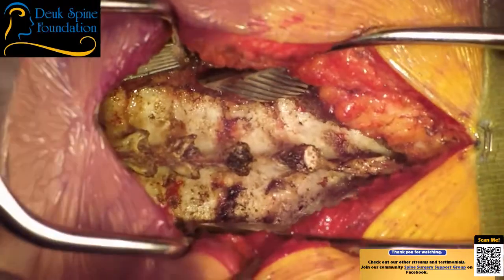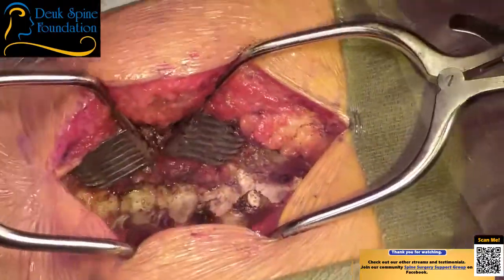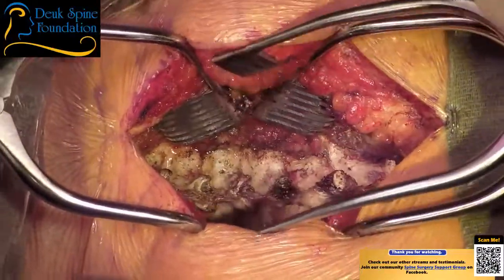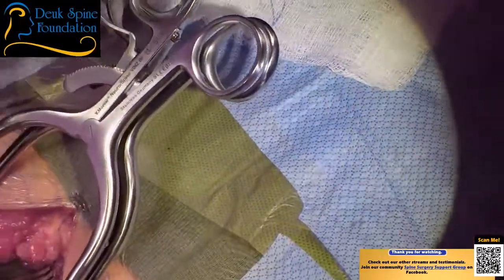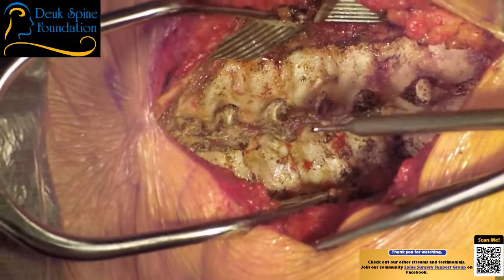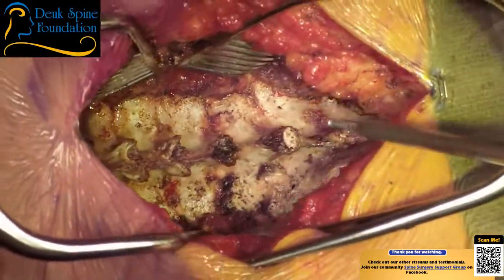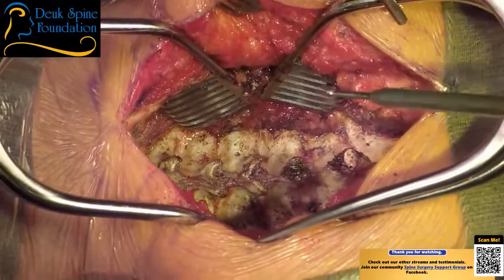bit more retraction or a little bit more dissection just to have it a little better. I've learned over the years exactly how much exposure I need. My only concern is my caudal exposure, but I can't do anything about it. And that's because this patient has so much soft tissue. So at this point, different surgeons do this part differently, okay? But we need to basically remove the lamina, and then I'm going to open the foramen as well. We're going to remove the lamina at 3, 4, 5, 6, 7. We're not doing T1 or T2.